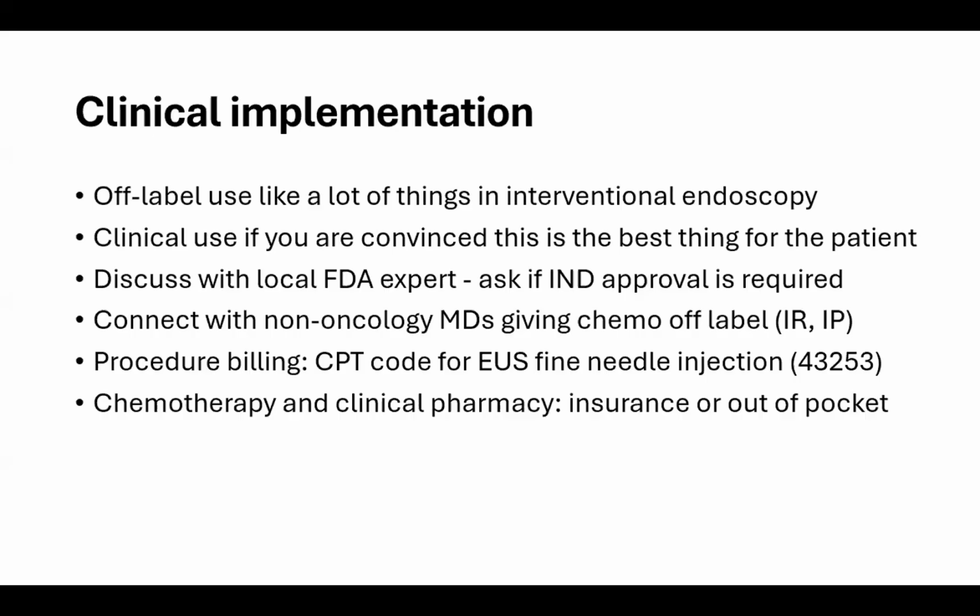And of course, we do a lot of things off-label in interventional endoscopy, like RFA and other things. But this is a totally different thing to work with. The first thing is you need to be convinced that this is going to work for your patient and you are offering it for clinical purposes.